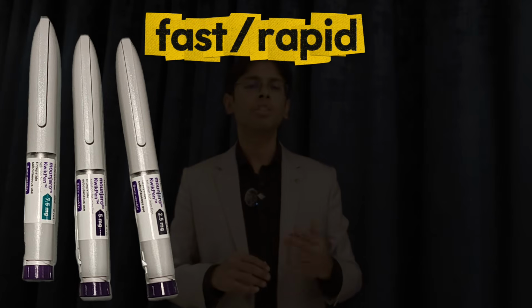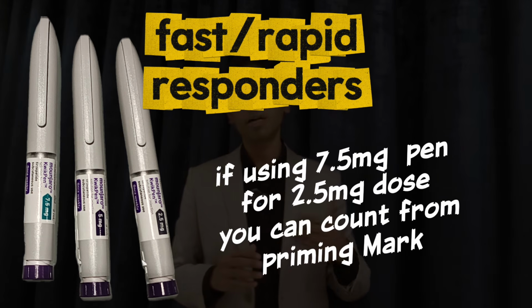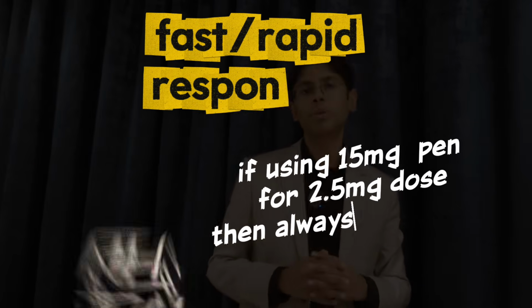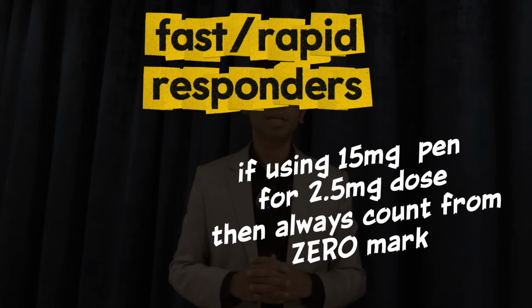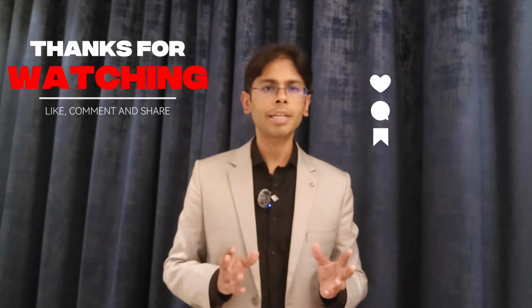In this case, you can actually start the click count from the mark after the 0.0 to slightly overestimate the dose, because you're doing the click counts. These are only estimates of the dose. They're not the exact dosages that you would be getting. However, they closely match what you should be expecting to have. I hope that clarifies where to start the click count for your Mounjaro Kwikpen device.